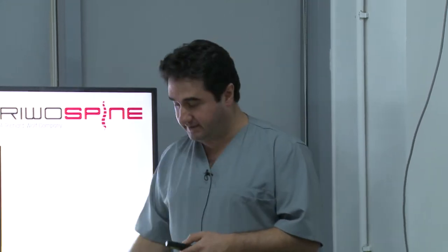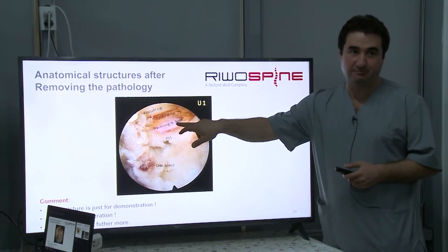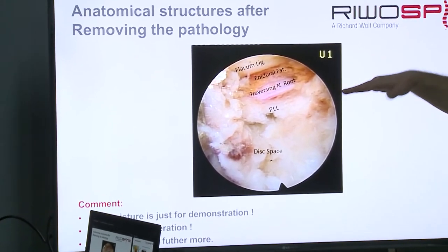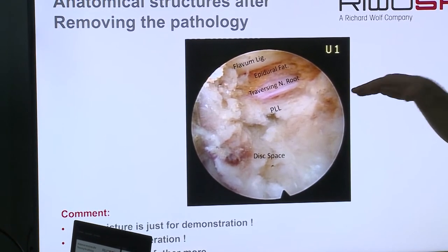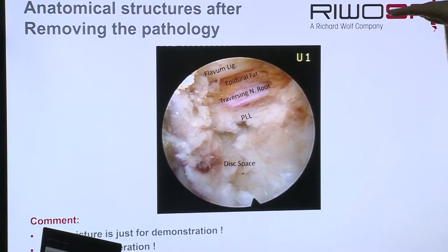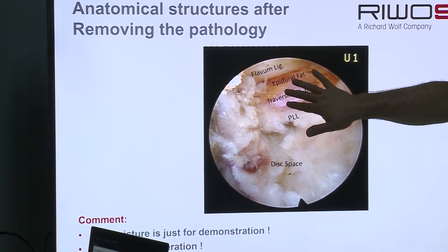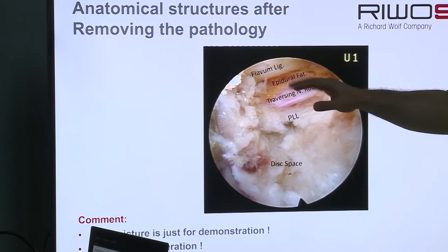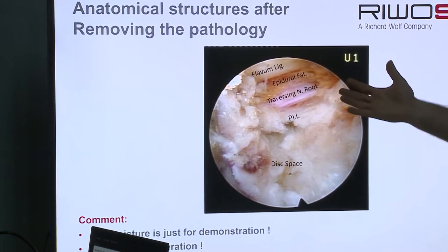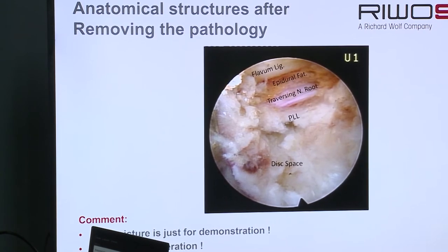And then, when you dissect the fat tissues, you see the nerve root here. But for the operation, you don't need to see it, because we already removed the herniation. And if you see the free floating of the PLL, then it's okay for the patient. You don't need to dissect that, because there are a lot of adhesions and veins here. You can create bleeding and damage on the root, and it's unnecessary, because there is nothing here. You remove the herniation.